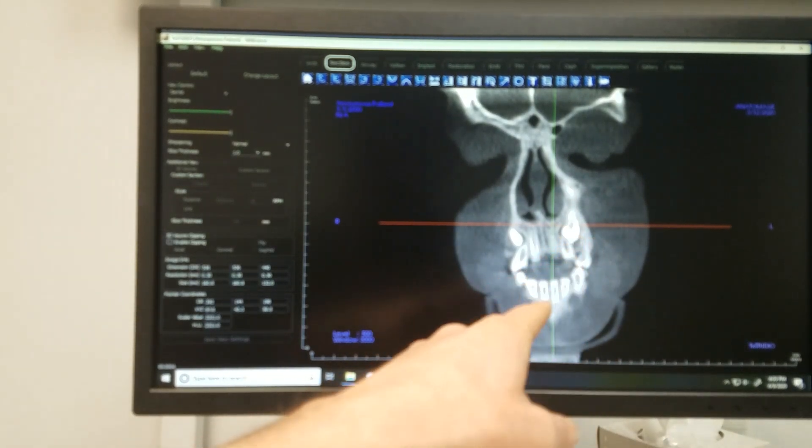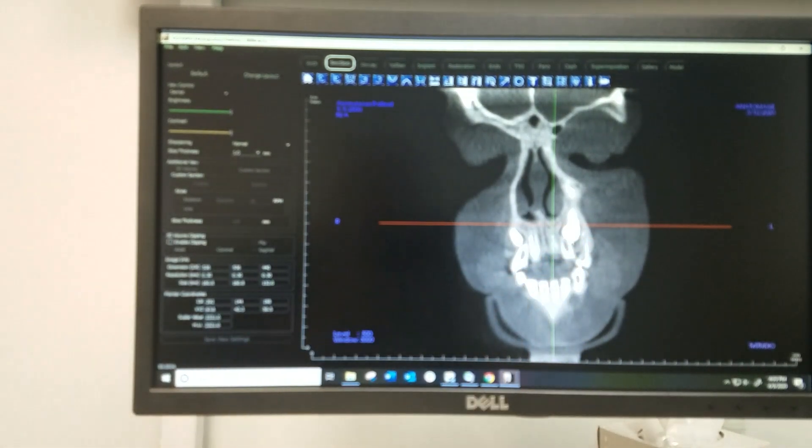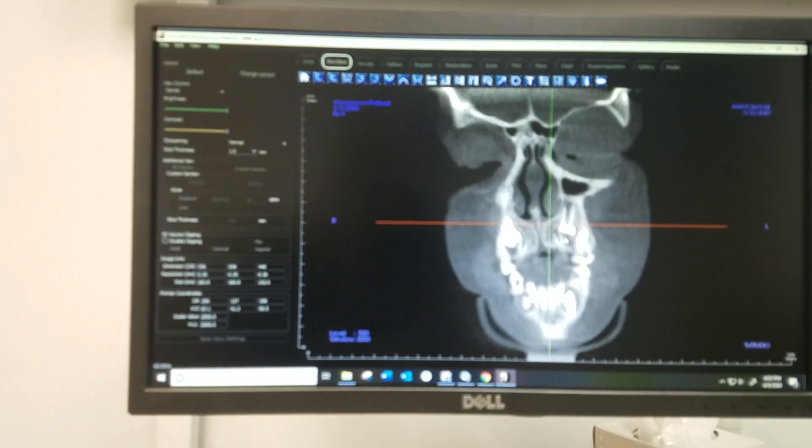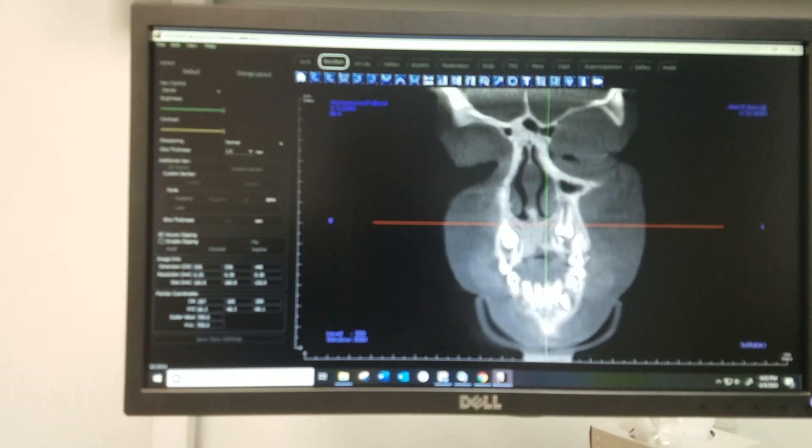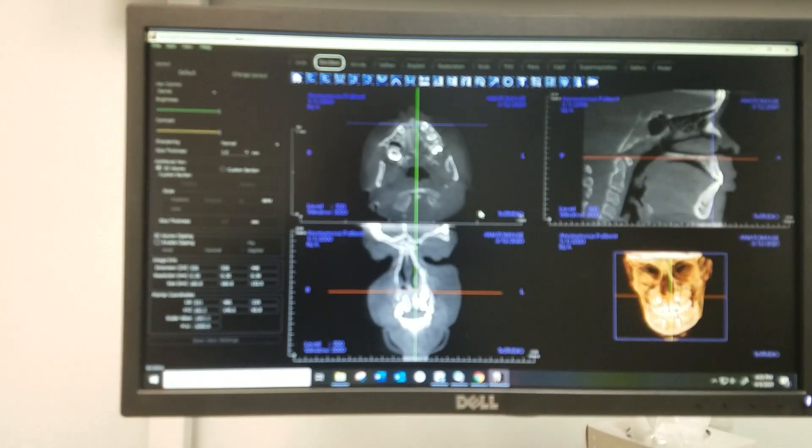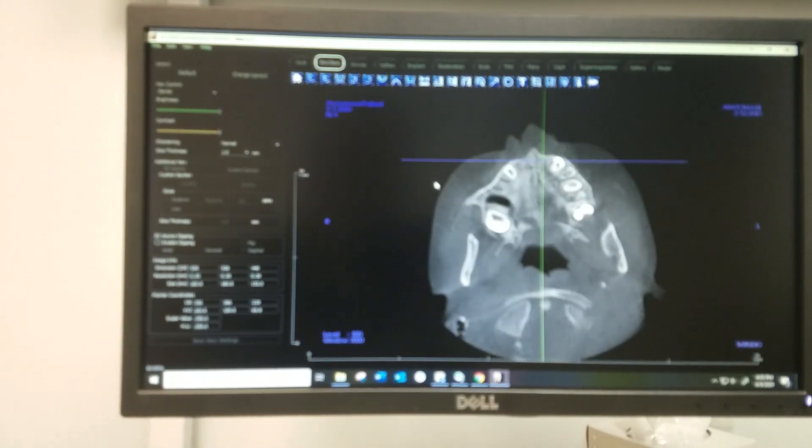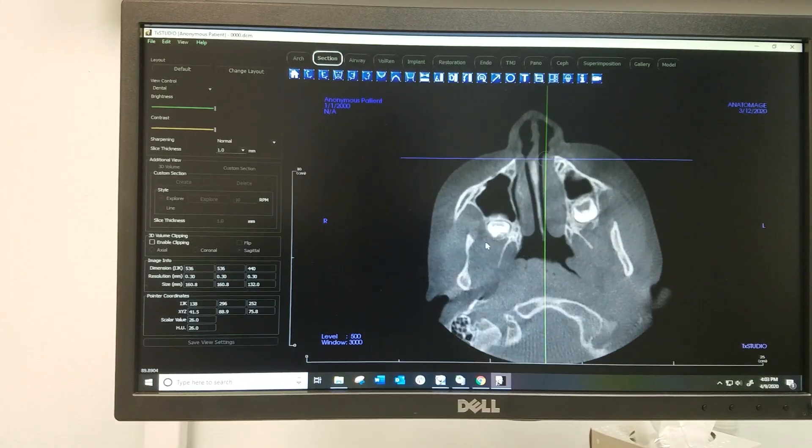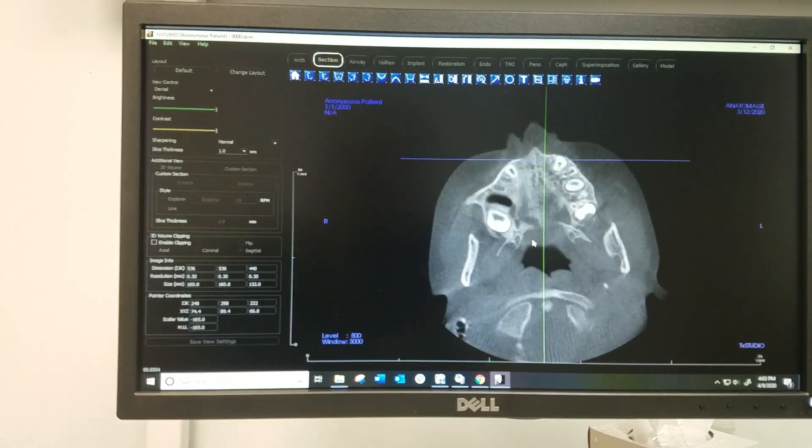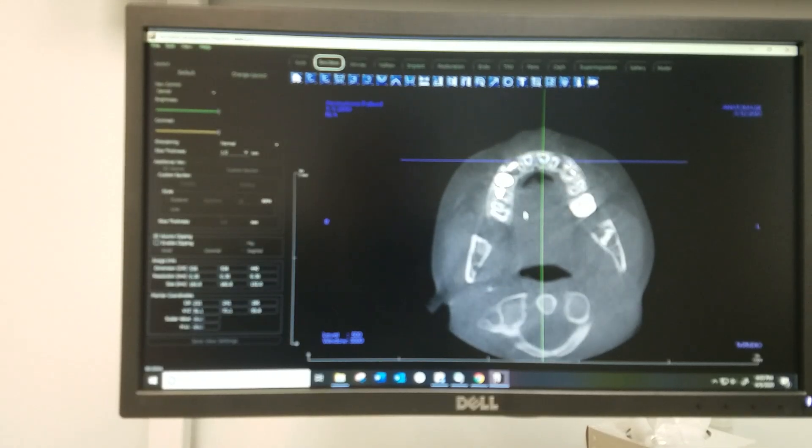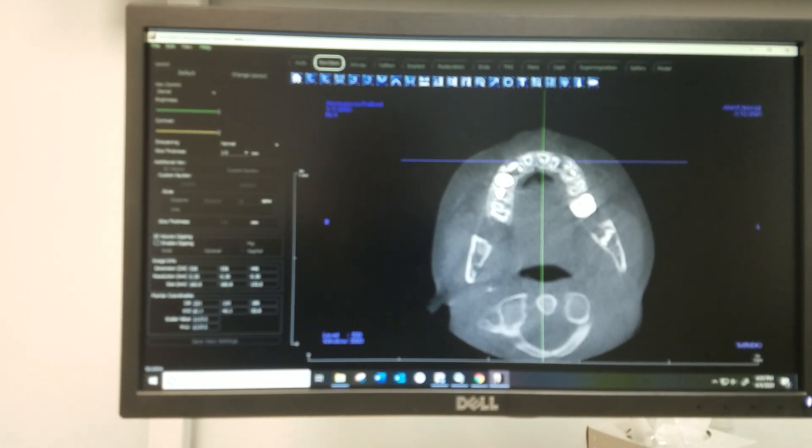Again, this is what we're looking at. Remember we were concerned about that canine being close to that root there, so we can get a better idea if that is in the safe zone or not. Let's see it from another view. I want to see it scrolling through. Here's the root tip. Oh, you can see that big follicle.